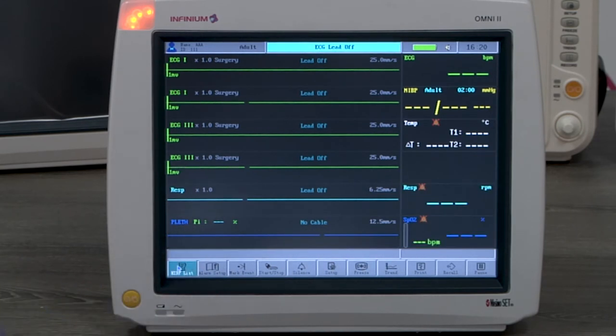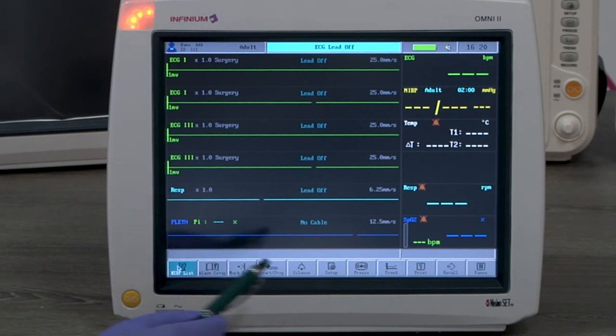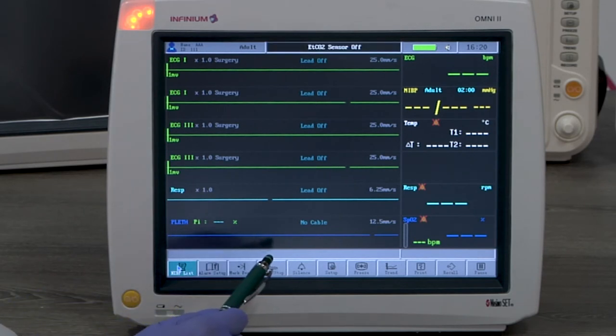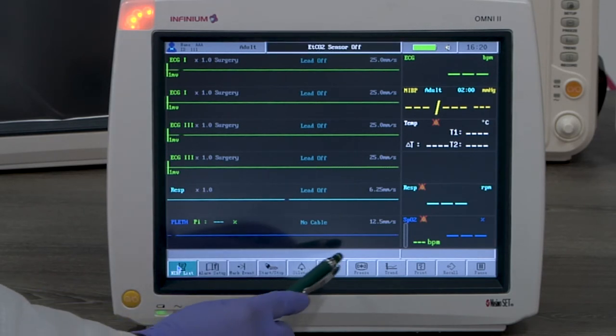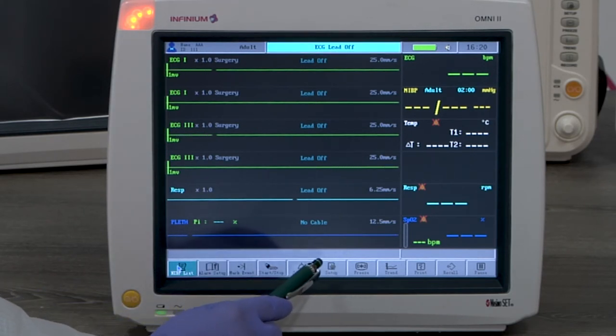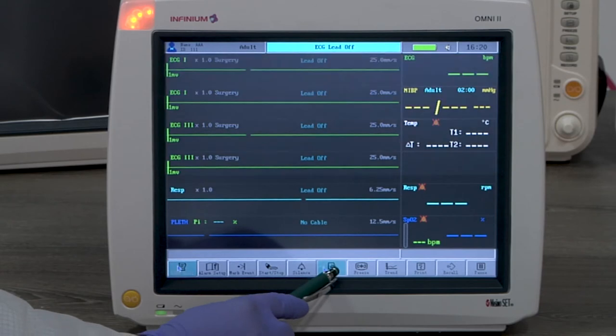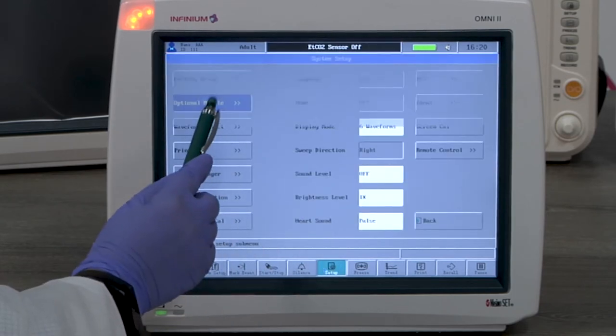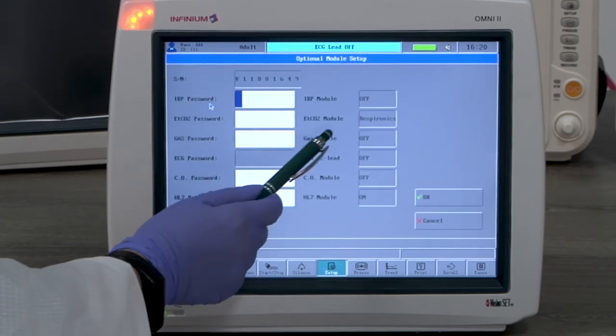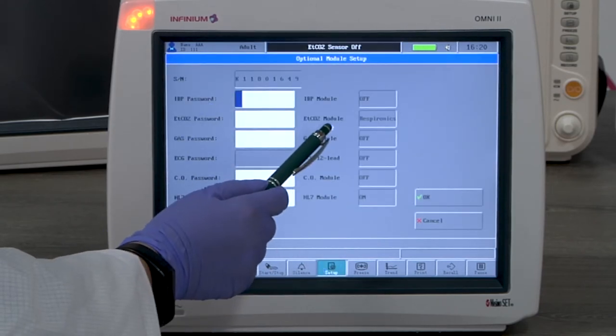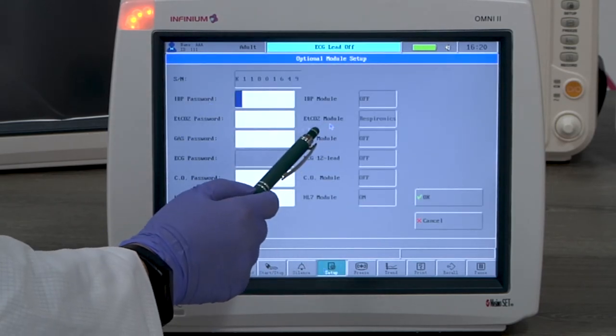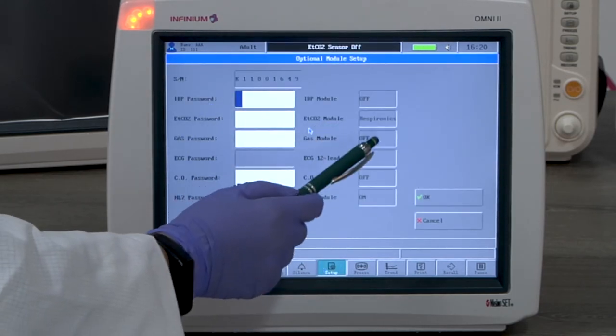Now let's look at ETCO2 monitoring. ETCO2 is an upgradeable feature. Its default is off, as are all the options. When it's unlocked, you'll see a CO2 type selected here.